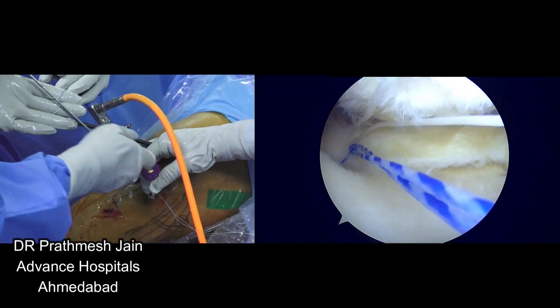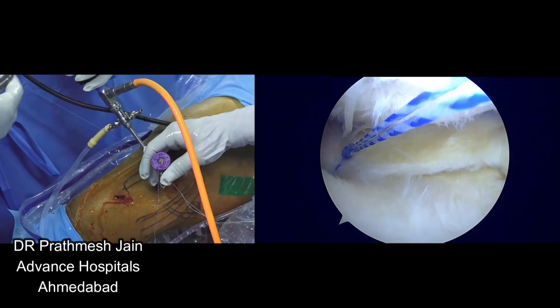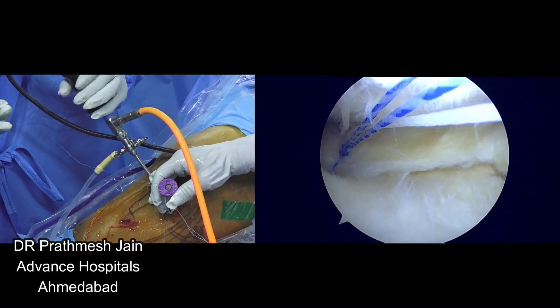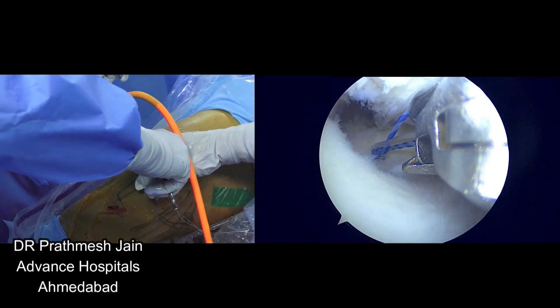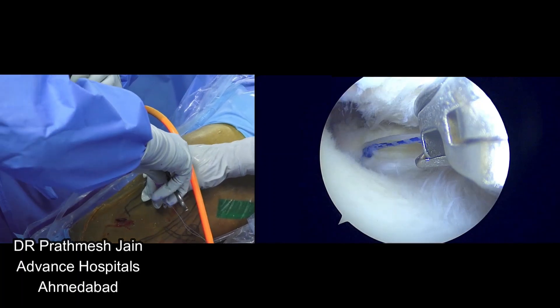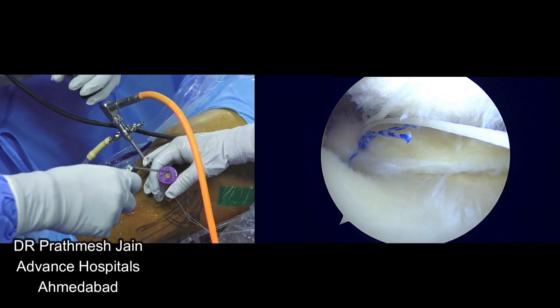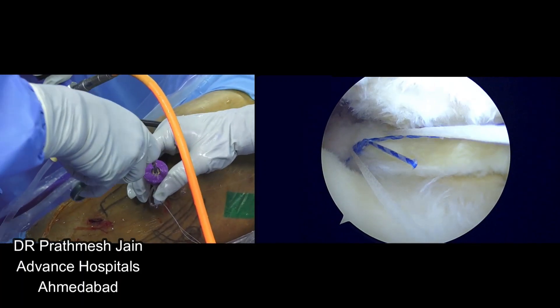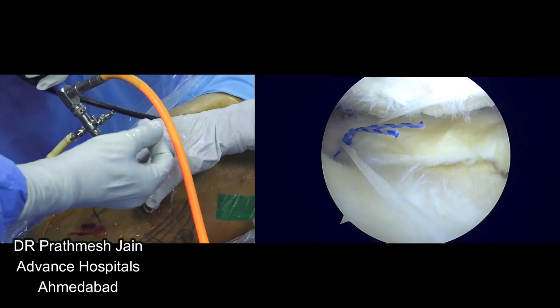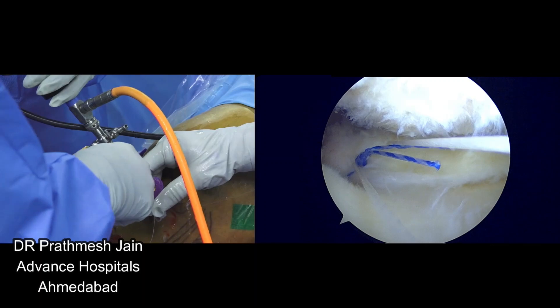We have locked it one and two — cutter please. Now we can just cut the sutures. With this simple single suture, we can see that the root which was torn is now reduced onto its place. The second suture — the white one — we will be using as the mattress suture to hold it into position, which is the purpose of the Mason Allen suture. In newer designs of the root fix anchor, we have replaced the white suture with a green colored suture so that there is ease for surgeons to identify the suture limb and suture management becomes much easier.